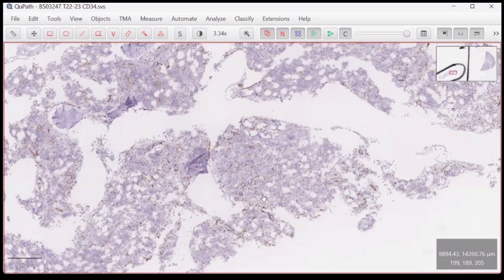If you get one or two cell clusters, fine, because you have brisk hematogones. What Prof. Bain mentioned was that when you are dealing with, say, 5% blasts on trephine, the pattern of clusters becomes very essential.